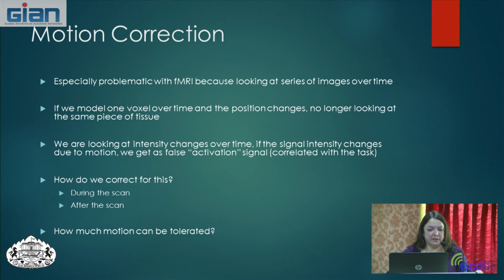You can correct for this during the scan and after the scan. So during the scan, a way to correct for this might be, like I mentioned, to pack this person's head in as tight as you can without having them feel really uncomfortable. And people have tried packing heads with other things other than pillows, because pillows also leave you a little bit of room for wiggle.